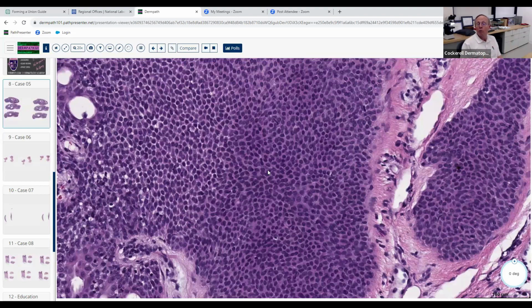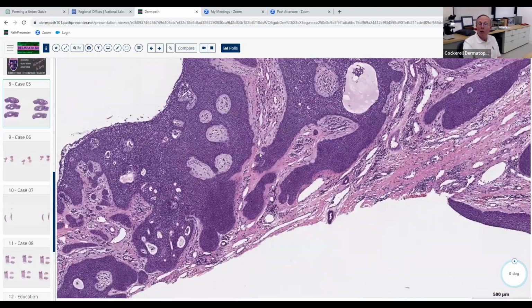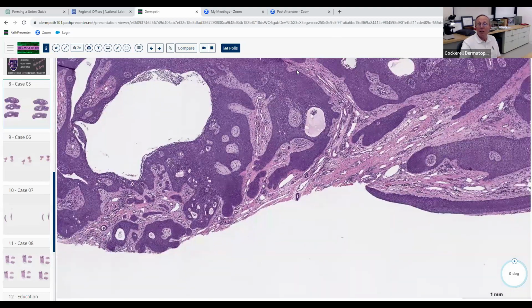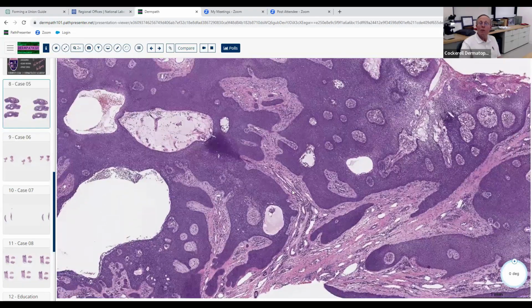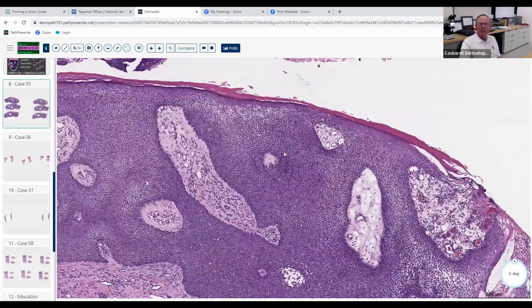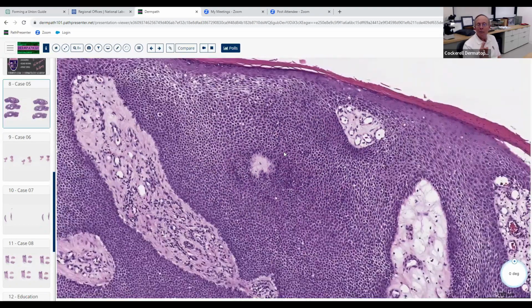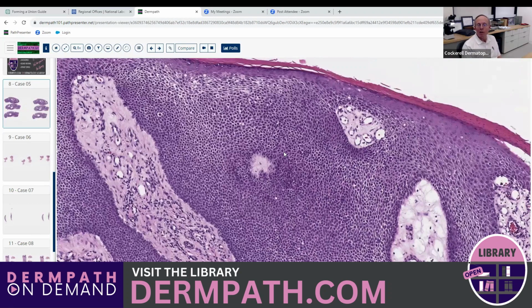Then there's a thing called the dermal duct tumor, where you see the same kind of poroid differentiation, but there's no contiguity with the epidermis. And then the last one is a poroid hidradenoma. And then you can get malignant lesions of this differentiation. So this is poroid differentiation. I guess the guy that originally called it poroma thought it was like the pore of an eccrine unit. So that's why they called it poroma.